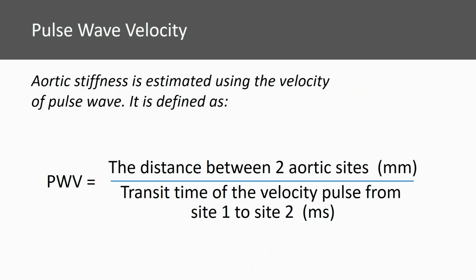As we discussed previously, pulse wave velocity is always measured at two sites. It is best to make these measurements simultaneously, as is possible with our Doppler system, as you are looking at the same beat from the heart. Doing these measurements sequentially introduces many unknown variables, such as changes in the R-to-R interval, changes in heart rate, for example, and most importantly, if you're looking at a pharmacological intervention, the transient effects of the compounds may vary between the two heartbeats.